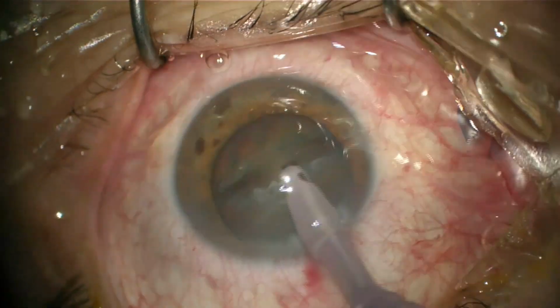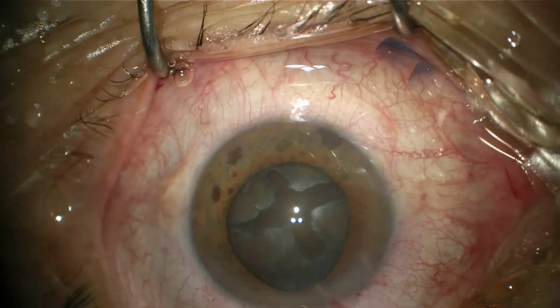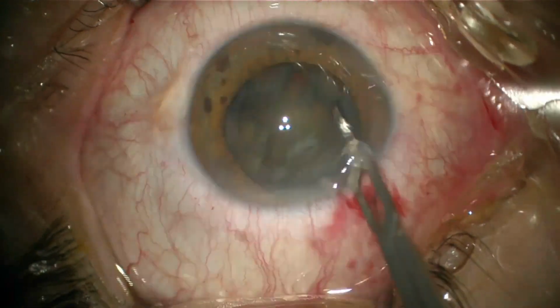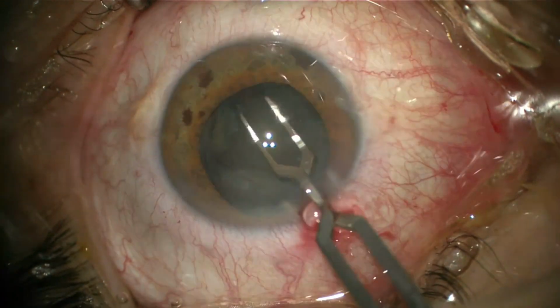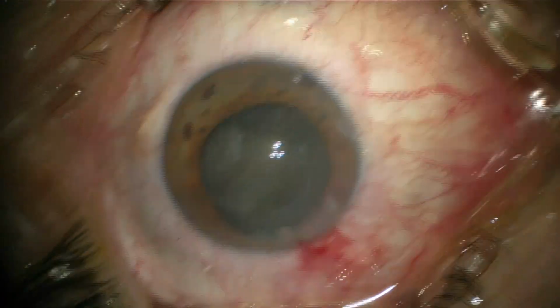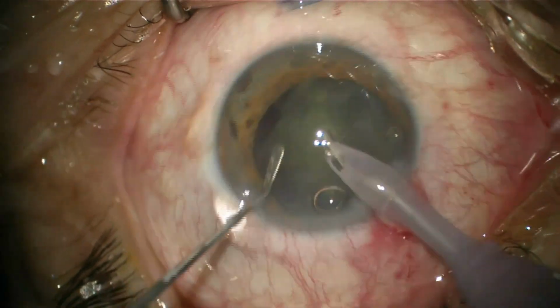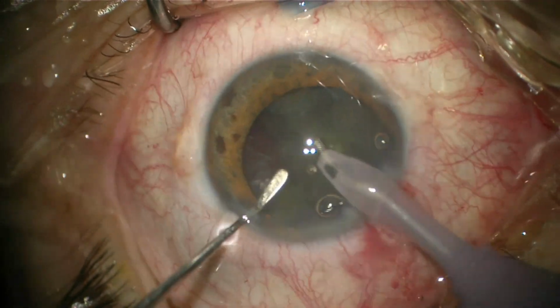Here comes the first central groove. Now rotate and do the second one. Here comes the pre-chopper, a nice and easy split between each group, to then aspirate each small quadrant with the phaco tip. At this point, it looks nice.